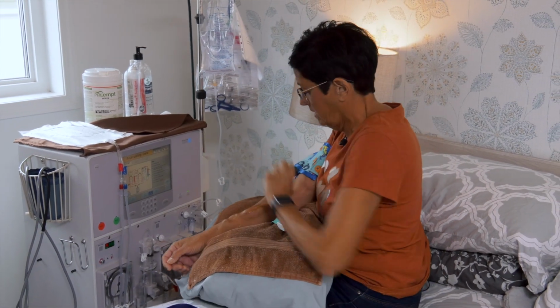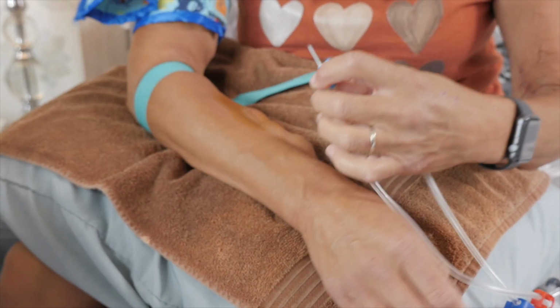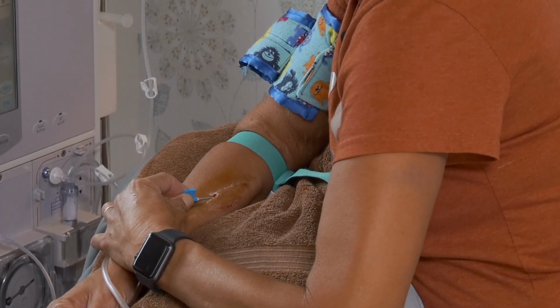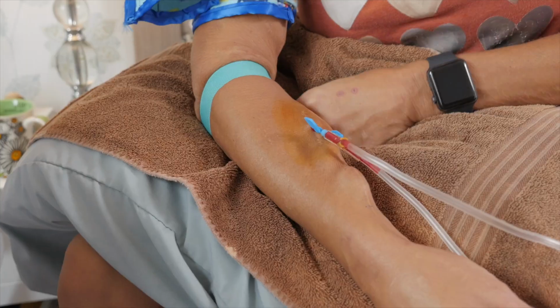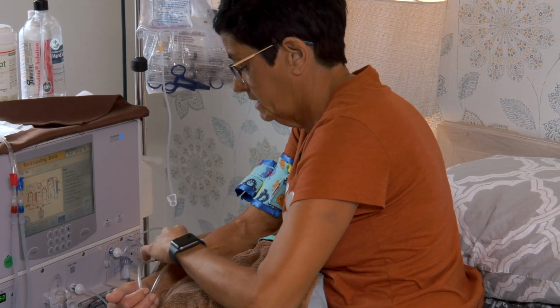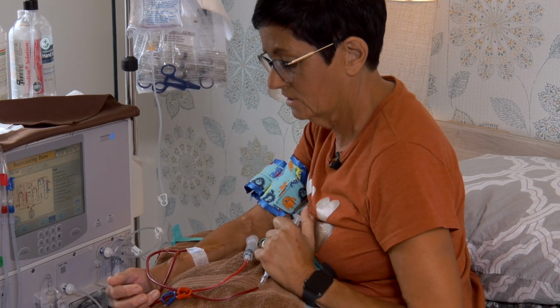Okay, here's a needle. Turn it over, kind of pull your skin back a little bit, and in it goes. Let the tourniquet off. Tape it down with the tape that's a little more flexible, and then check your lines to make sure that it works good before you tape it right down.